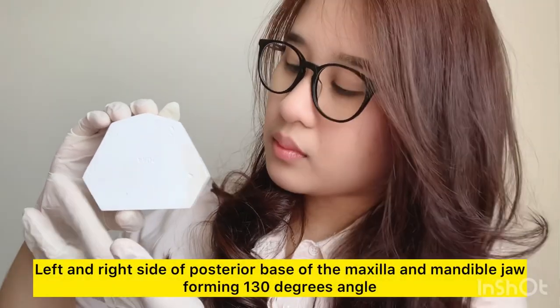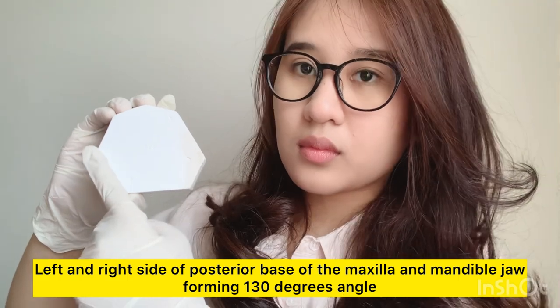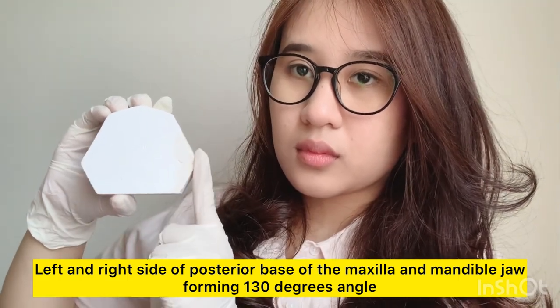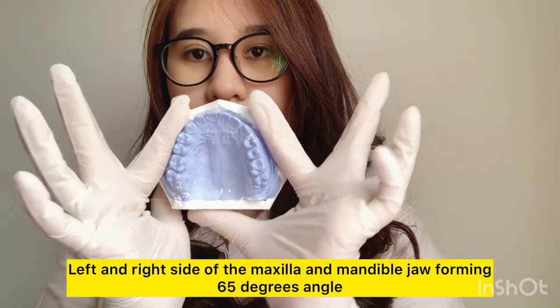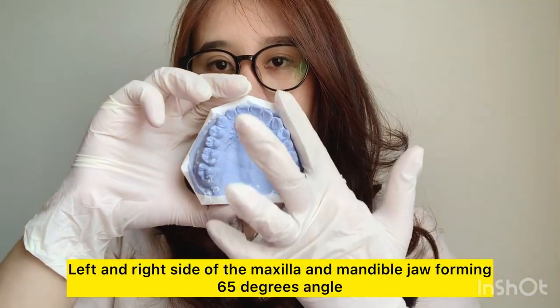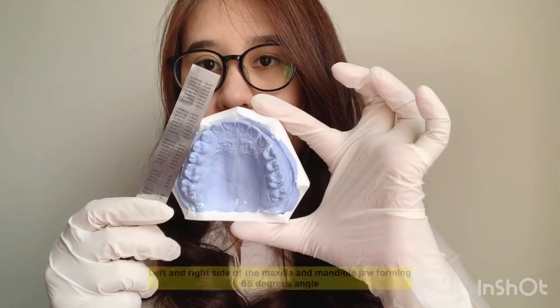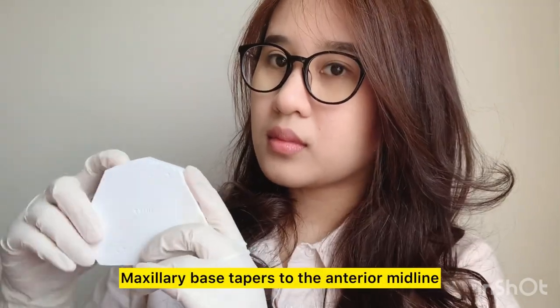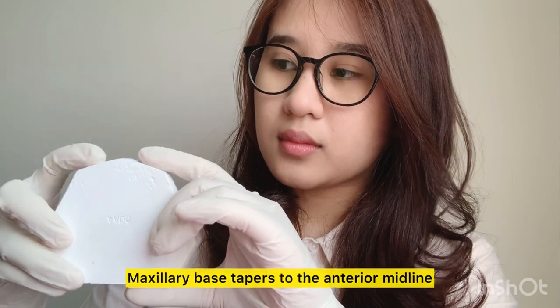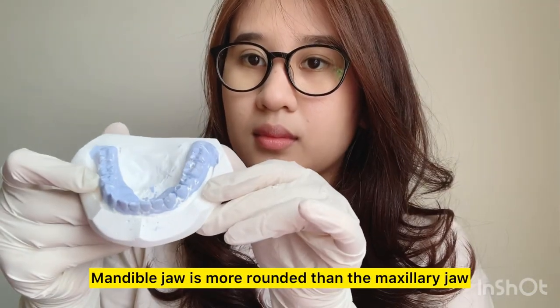Meanwhile, the left and right posterior bases of the maxilla and mandible jaw form a 130 degrees angle. The left and right sides of the maxilla and mandible jaw bases should form a 65 degrees angle. The shape of the maxillary base tapers to the anterior midline. Meanwhile, the shape of the base of the mandible jaw is more rounded than the maxillary jaw.